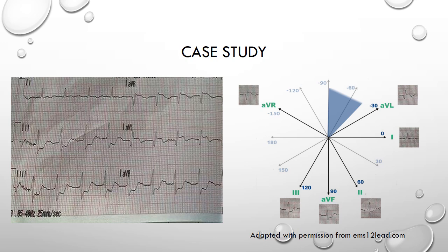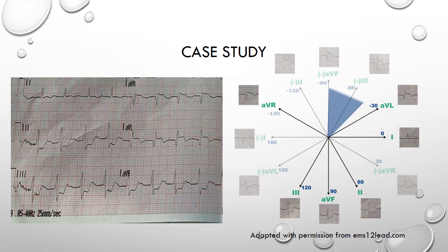You should also be able to see that the ST axis or vector is traveling directly away from our inferior leads, in particular leads 3 and AVF, and this is why we get reciprocal ST depression in these leads. What then if we created a view of the high lateral wall by following the Cabrera format of reversing AVR to create a mirror image in minus AVR and did the same with our inferior leads? By creating minus 3 and minus AVF, we now see that we have ST elevation in more than two contiguous leads from AVL in a counterclockwise direction towards AVR.